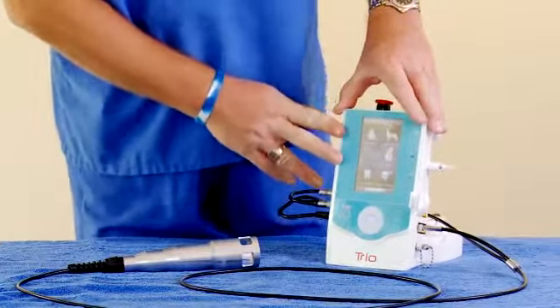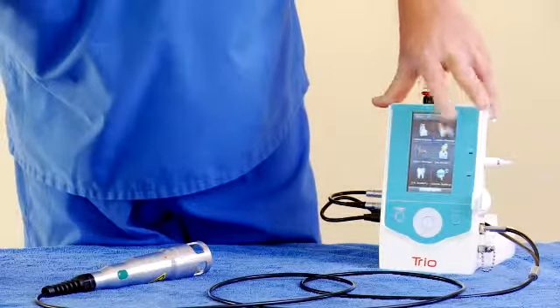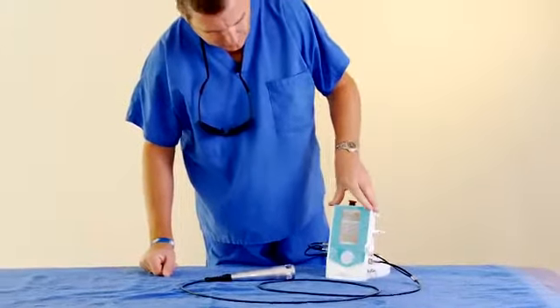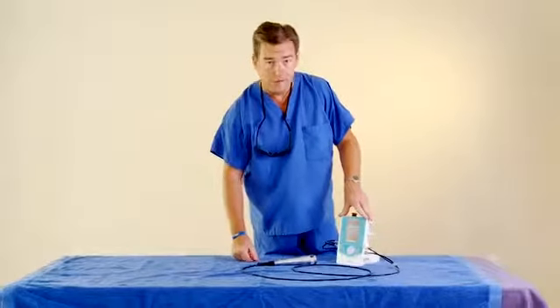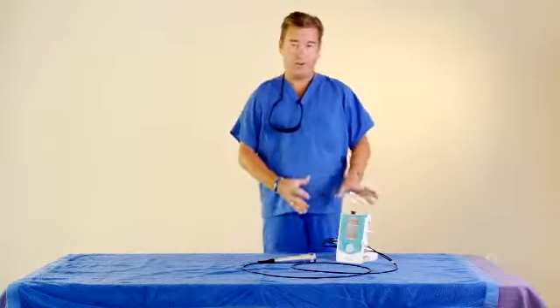After you're in the main menu, you can choose the species that you're going to treat with the therapy laser. Today we're going to do canine, and we have presets that are already predetermined for the typical dog. The typical dog would be 50 to 55 pounds. Depending on the size of the patient, you will want to turn the laser up or down.